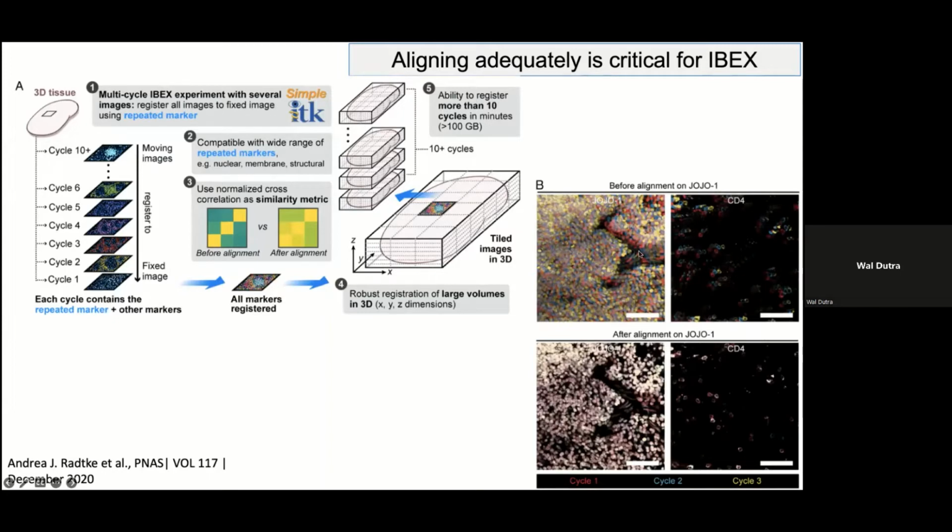So when you're collecting your sample, you look for things like this, weird images that you can compare between the two different cycles. And that will help guide you at the beginning where you're going to align your samples. And of course, when you're going to acquire, if you're not acquiring the entire tissue, you can choose the regions that have the funny structures or the marker structures that will allow you to align them properly later.